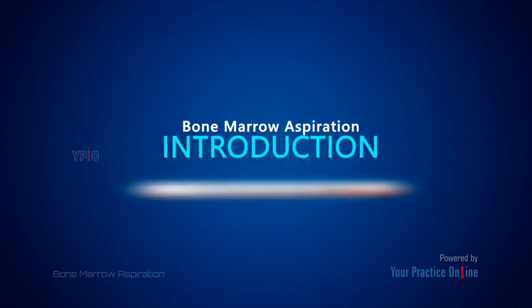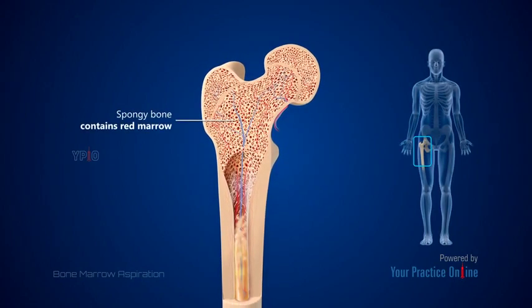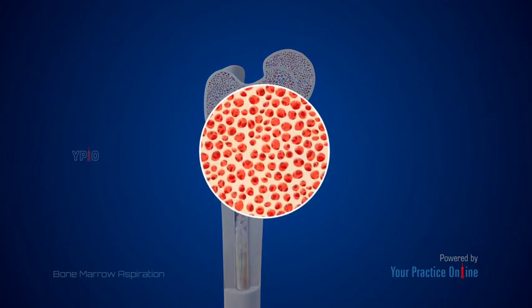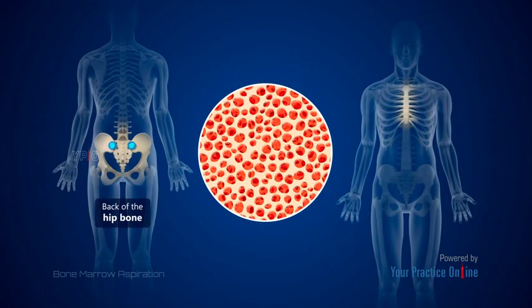Introduction. Bone marrow is the spongy tissue in the center of most large bones of the body. It is a highly vascular structure that produces most of the body's blood cells. A bone marrow aspiration is a procedure to collect the liquid portion of the bone marrow. The bone marrow is usually aspirated from the back of the hip bone, but it can also be obtained from the breastbone.